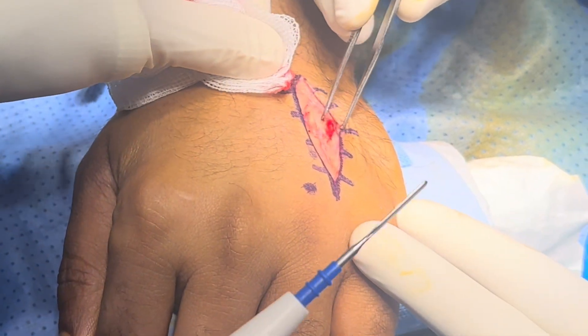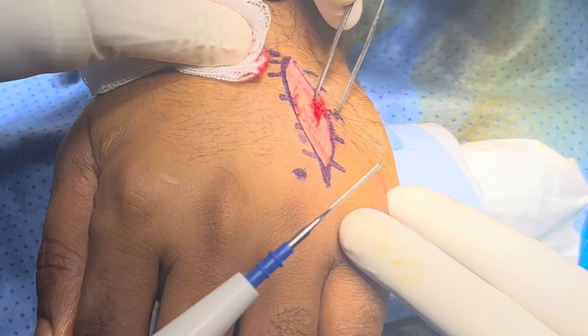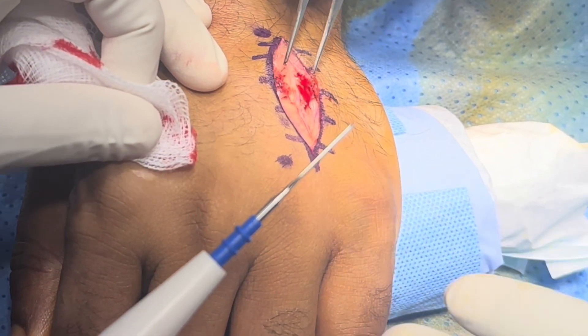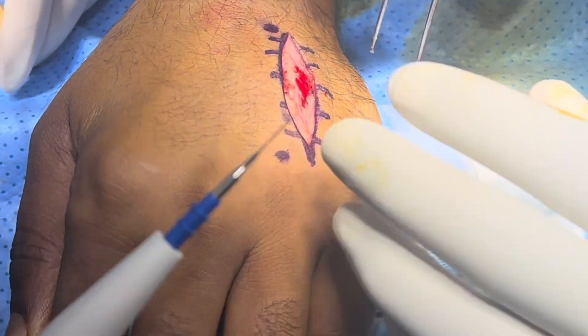This is the digital nerve — we have to protect this. After that, we will expose the extensor tendon.